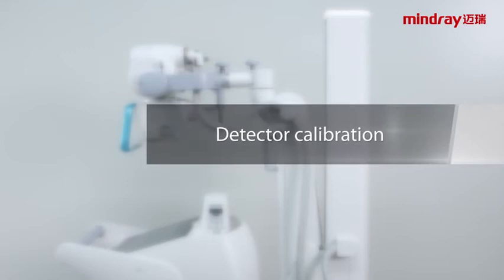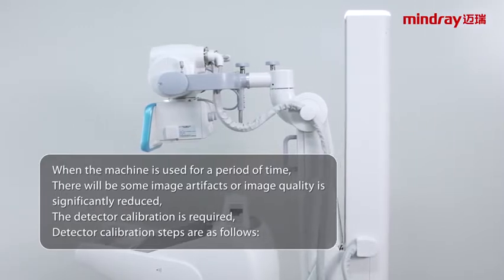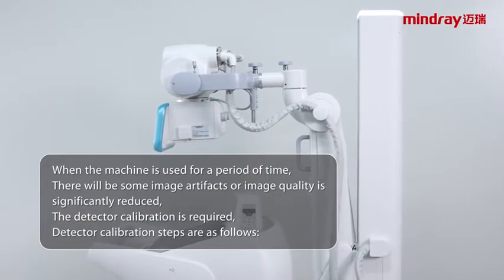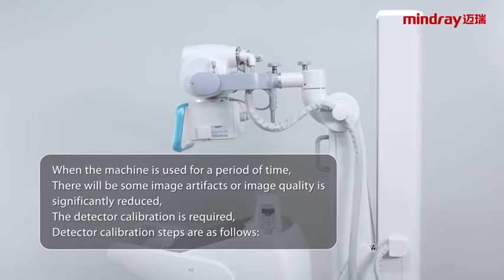Detector calibration. When the machine is used for a period of time, there will be some image artifacts or image quality is significantly reduced. In that case, detector calibration is required. The detector calibration steps are as follows.